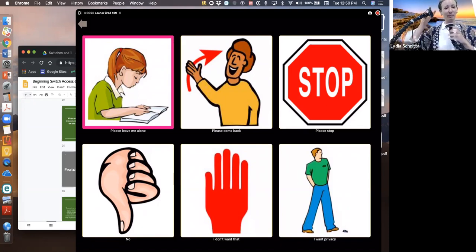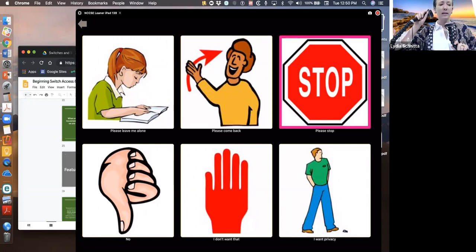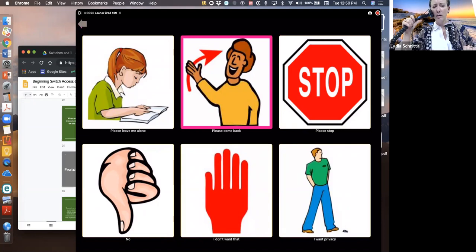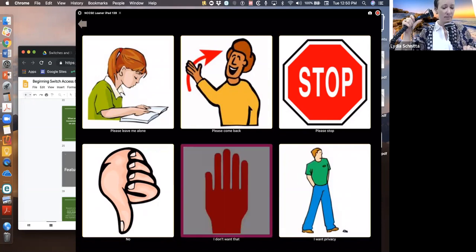Okay, so this one is stepping, and this one is selecting. So I'm going to, and this is again level 4, and I'm going to say in my head when I'm doing this, no, no, no, no, yes. I don't want that.